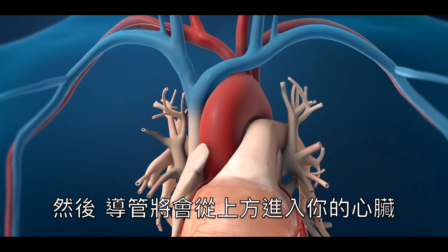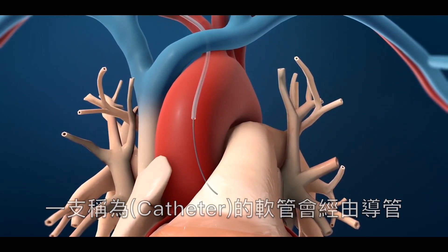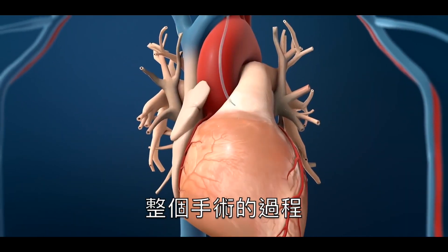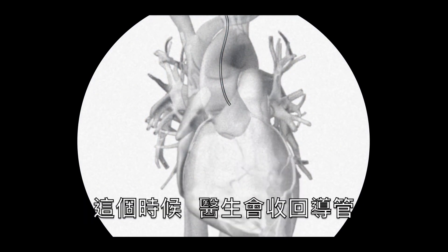Next, the guide wire will be advanced up to your heart. A flexible tube called a catheter will be advanced over the wire to your coronary arteries. The progress of the procedure will be checked with an x-ray device called a fluoroscope. At this point, your doctor will remove the guide wire.